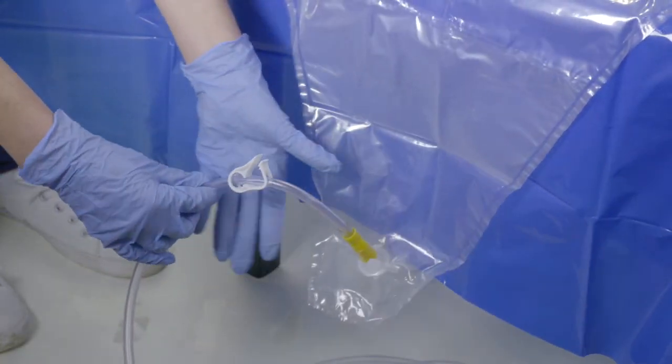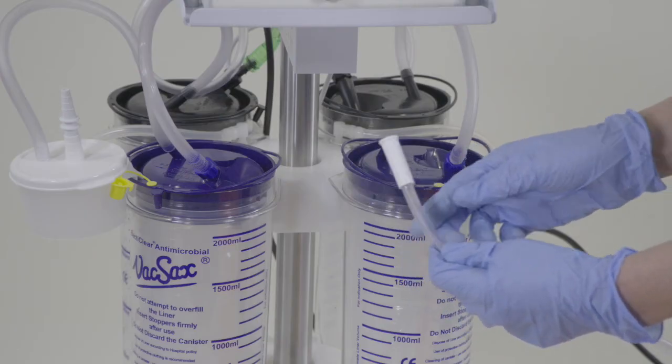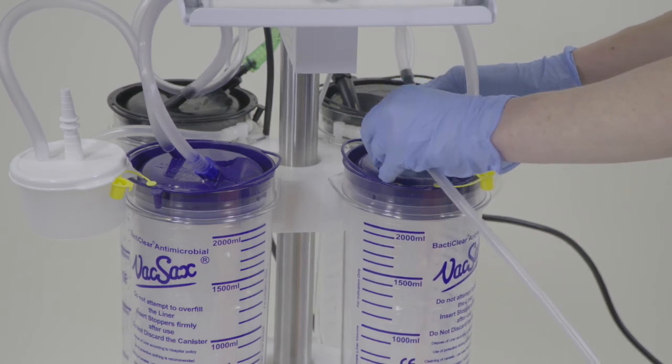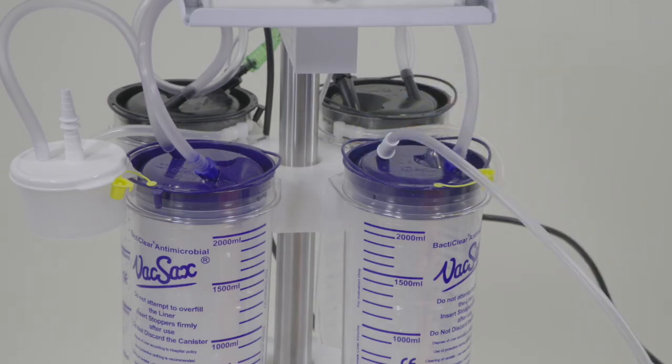Ensure you do not clamp the tubing as shown. The white tip end will be handed to the circulator and inserted into the right front canister as shown. Outflow setup is now complete.